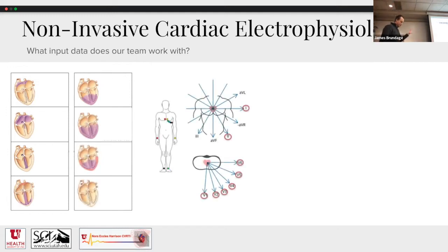This is electrical activity at the heart surface, but we can record it from the body surface, of course with some smoothing as the signal propagates through tissue. We have electrodes placed on the body surface that measure the electrical propagation of the heart across different measurement vectors. Different vectors give us different perspectives on this propagation, which can give clinical insight into electrical heart propagation that might be clinically impactful, as well as some mechanical issues that can affect it.